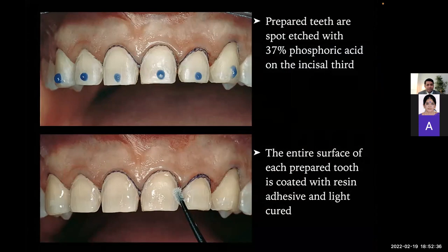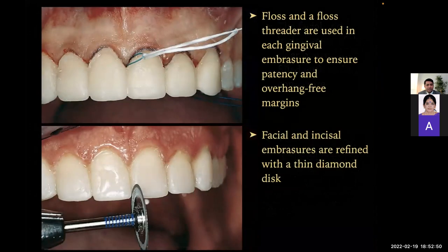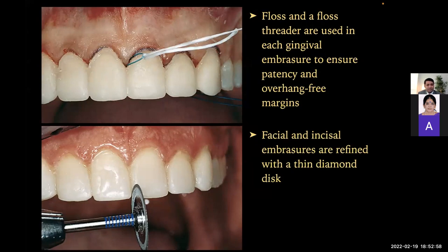The entire surface is etched, the tooth is coated with resin adhesive and light cured. The facial and incisal areas of the clear matrix are filled with resin composite. The filled matrix is placed over the prepared tooth. Floss and floss threader are used in each gingival embrasure to ensure patency and overhang-free margin. Facial and incisal embrasures are refined with a thin diamond disc. Make sure you have covered the patient's lip and tongue, as otherwise it could be a disaster. Give the patient instructions to stay still during that procedure.